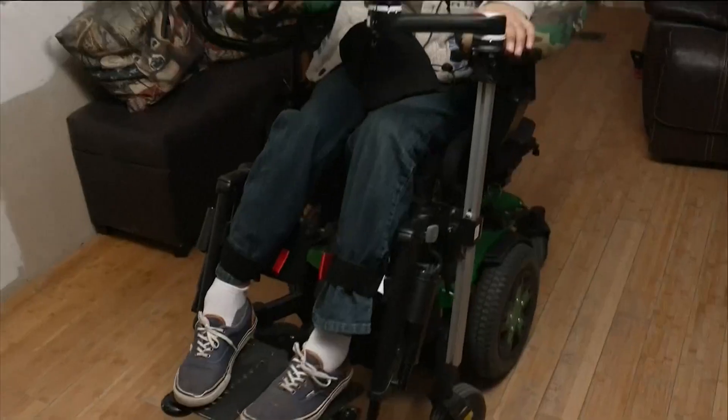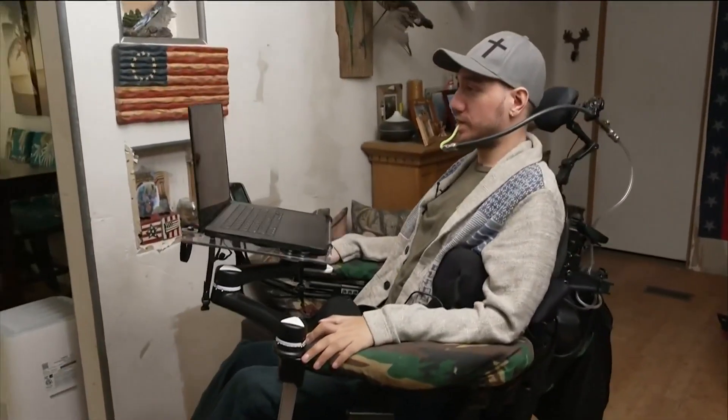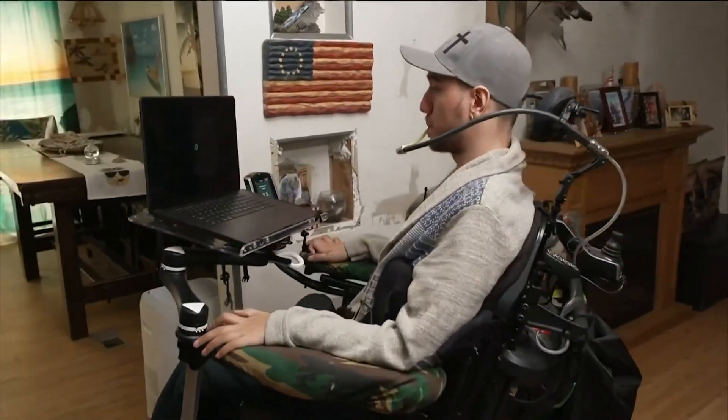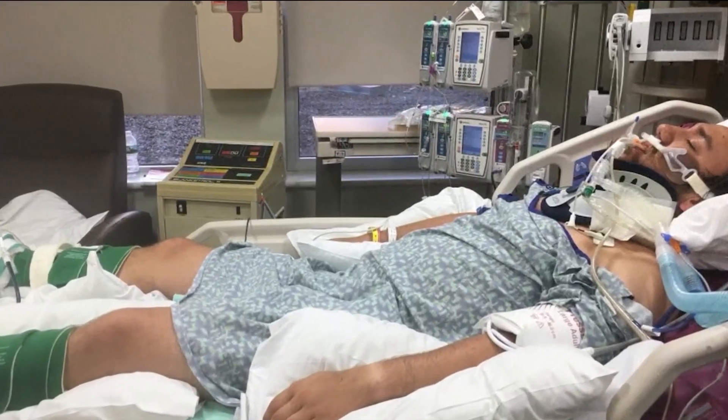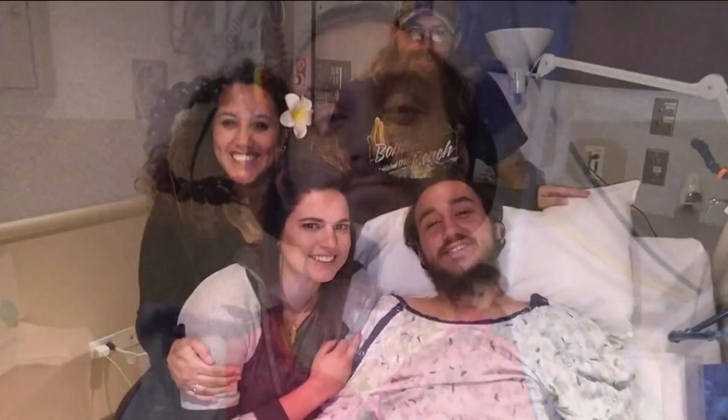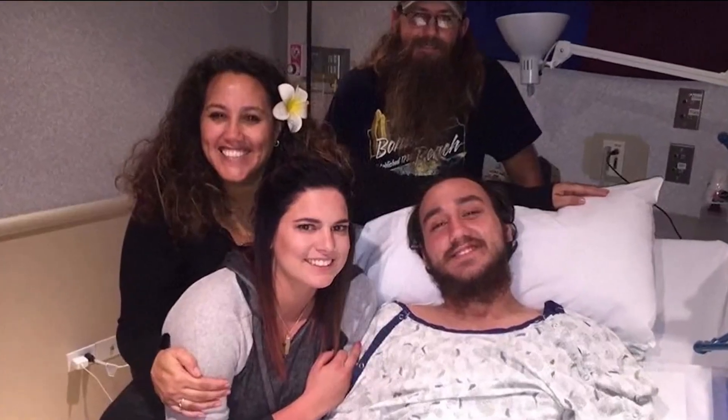The pioneering recipient of this revolutionary technology was Noland Arbaugh, a 30-year-old resident of Yuma, Arizona. Arbaugh's life had been profoundly altered by a swimming accident in 2016, leaving him quadriplegic, paralyzed from the shoulders down. His participation in Neuralink's initial human trial presented an unprecedented opportunity to explore the potential of BCIs in restoring lost digital autonomy and offering a pathway back to interaction with the digital world.